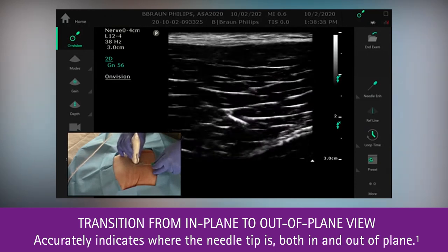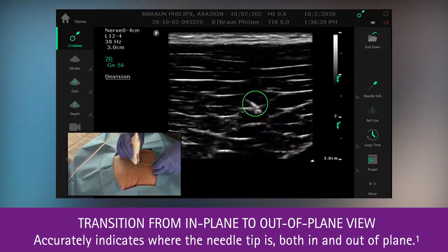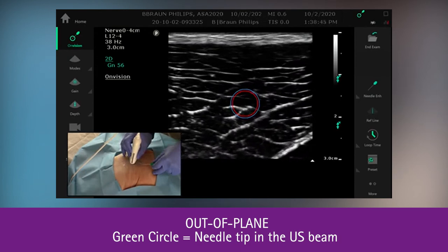The other advantage that we have is that we're able to transition from an in-plane approach to an out-of-plane position and still maintain visualization.